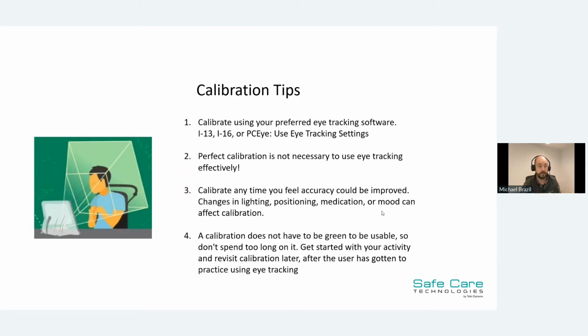Just to note as well, changes in lighting, positioning, and medication or mood can also affect calibration. So sometimes, if someone might be heavily medicated at a particular time, or if the room is too bright, for example, you mightn't get that accurate calibration that you want.